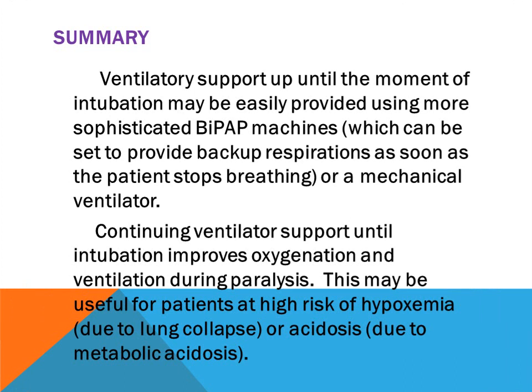In this scenario, lung recruitment only occurs during inspiration. The transpulmonary pressure at the time of inspiration, when lung recruitment occurs, is plus 30 centimeters. But at the time of exhalation, the transpulmonary pressure decreases to minus 3 centimeters. This de-recruits the lungs. So the primary factor opening up the lungs is actually the peak pressure of BiPAP.